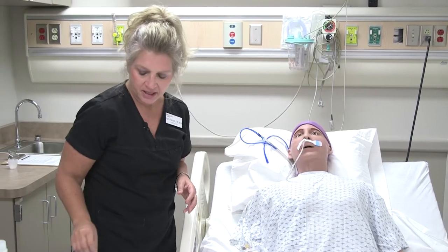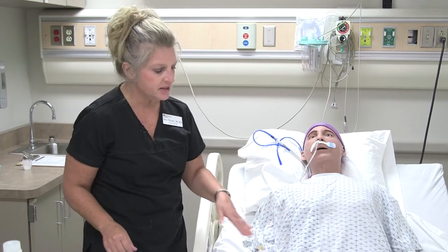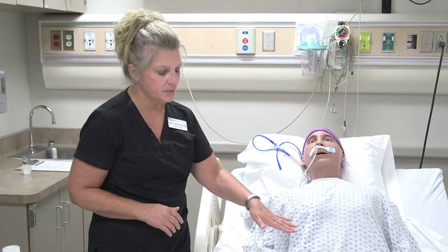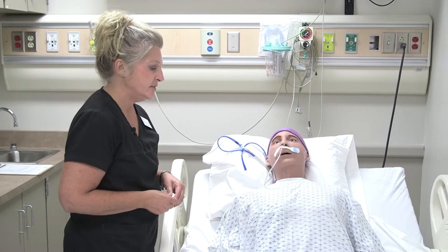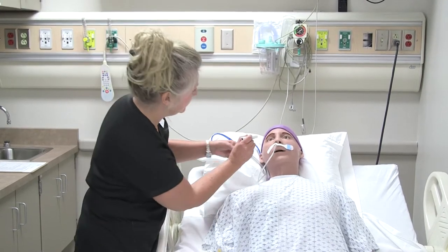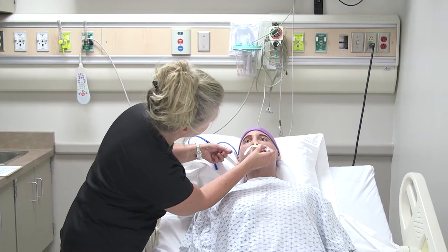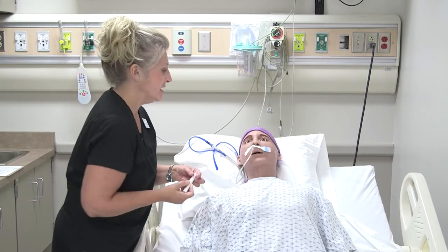Before putting anything in the tube, we want to do a gastrointestinal assessment. That includes listening to the bowel sounds and making sure those are present. You also want to ask the patient if they're having any bloating, cramping, or diarrhea. You also want to inspect the nares to make sure they're not swollen, everything looks patent, and the patient isn't having a lot of discomfort.